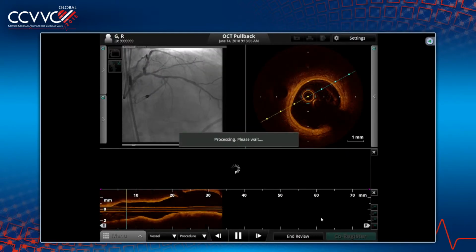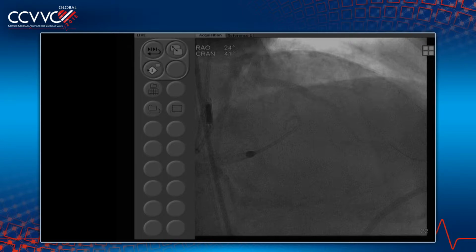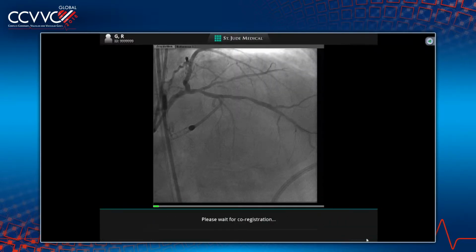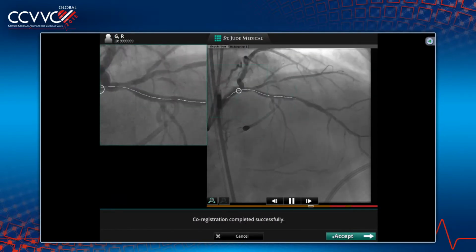So are you going to show us the app, or this particular app you have to download? You'll see it. Okay. Just go to the App Store, Octade. OCT, you download and start using it on your iPhone right now. Roberto already has it. Roberto has already got it on his. Yes. What is it called? So it's OCT8, Octade. I mean, there are several ones. There's one for transseptal, there's a bifurcation one, there's all of them.